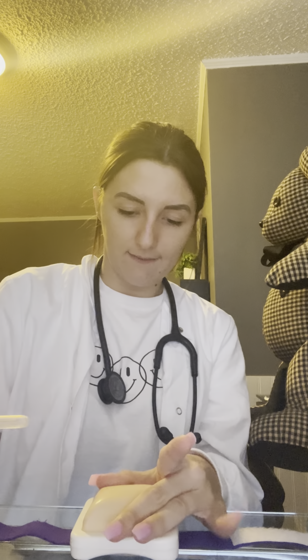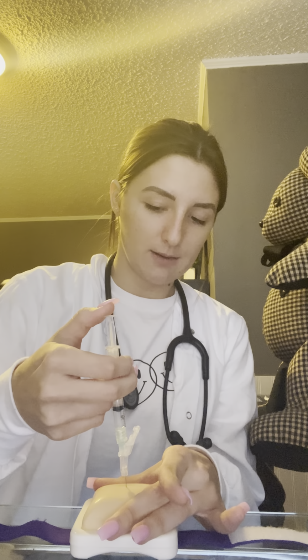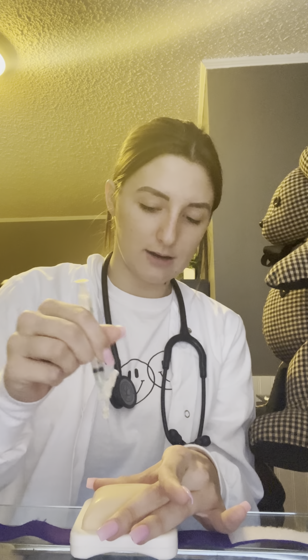With my non-dominant hand, I'm going to find the muscle in the upper arm. Maintaining my sterile technique. With intramuscular, you're supposed to give it at a 90-degree angle, so that's exactly what I'm going to do with the bevel up, okay? 1, 2, 3. You're supposed to pull back on the syringe, and if there's any blood that comes in it, you stop giving the injection, but I don't see any blood. So I'm going to go ahead, stabilize the syringe, go in at a slow and steady pace, and then I'm going to take it out. I would dispose of that in the waste box or waste basket, but I'm just going to cap it for right now.